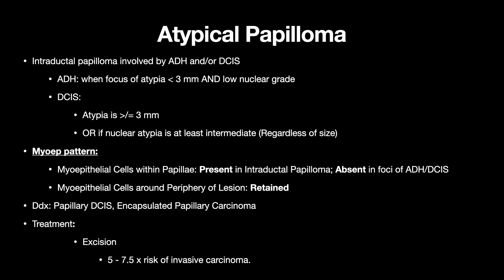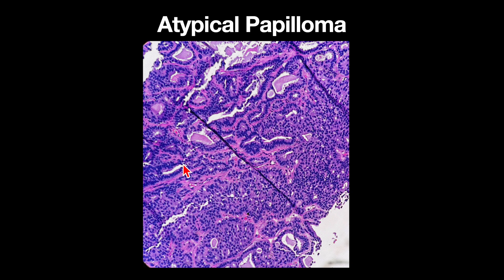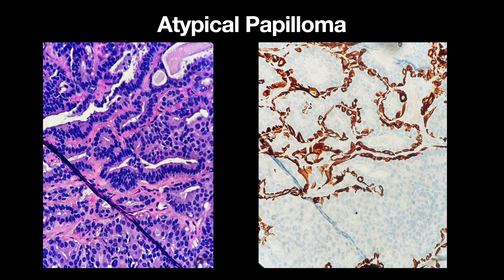Your differential diagnosis is papillary DCIS and encapsulated papillary carcinoma. Treatment is excision, as there is a 5 to 7.5-fold risk of invasive carcinoma. Here we have a region of intraductal papilloma with hyaline stroma — you can imagine there will be myoepithelial cells if you look closely here. And then this region is more monotonous; it has a cookie-cutter shape and some nuclear atypia. With the myoepithelial stains, you can see the myoepithelial cells staining within the intraductal papilloma, and in the foci of DCIS it is absent.